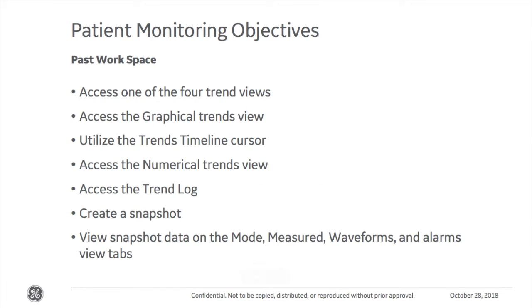Additionally, from the past workspace, access one of the 4 trend views, access the graphical trends view, utilize the trends timeline cursor, access the numeric trends view, access the trend log, create a snapshot, and view snapshot data.